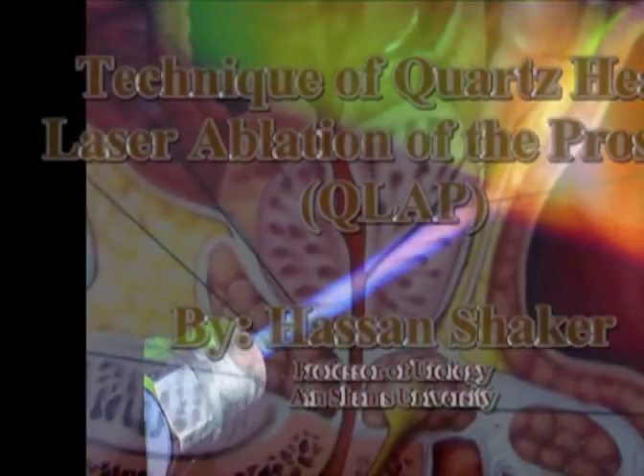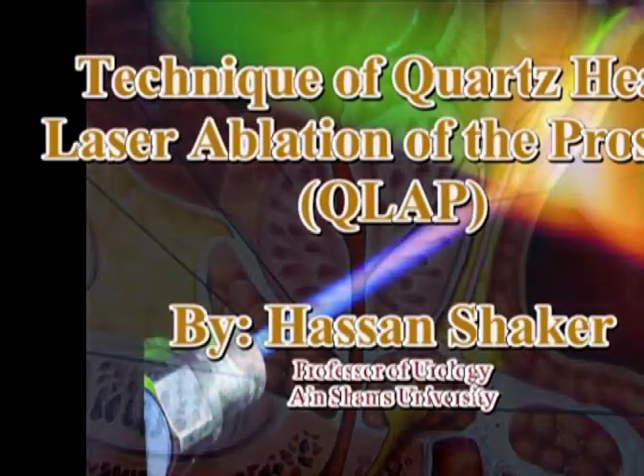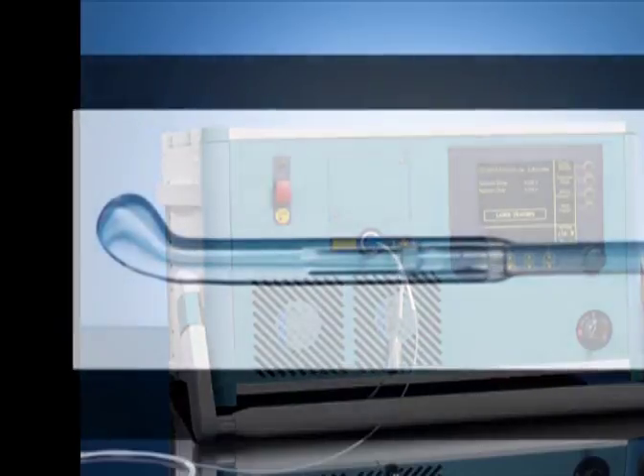In this video, we will demonstrate our technique for Quartz Head Laser Ablation of the Prostate, or Q-LAP. A 300 Watt diode laser system from Biolletic, Germany is used to produce 980 nm laser, which is conveyed to the patient by the quartz head fiber known as twister fiber.